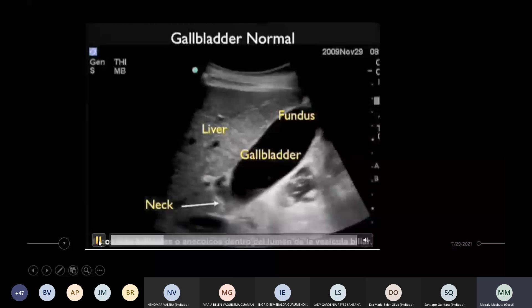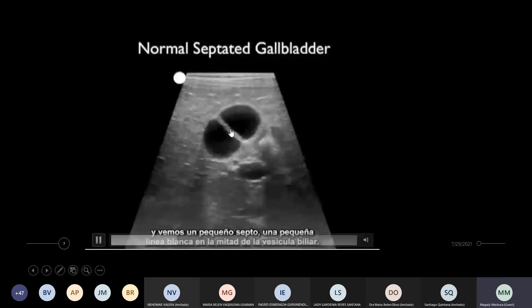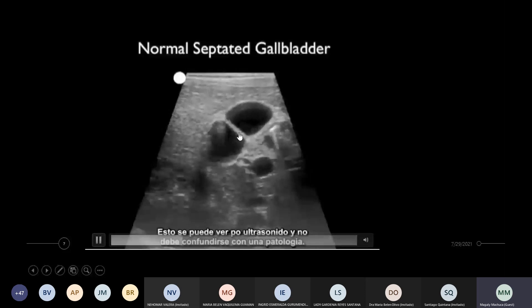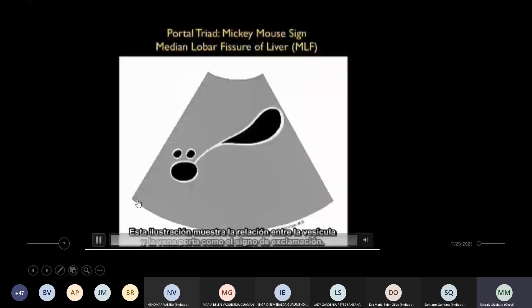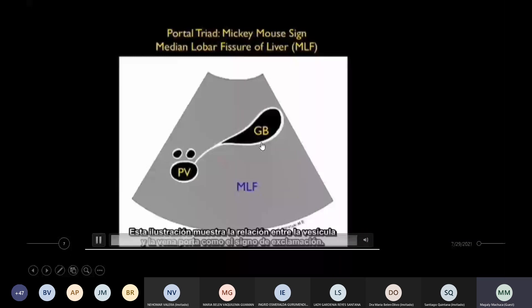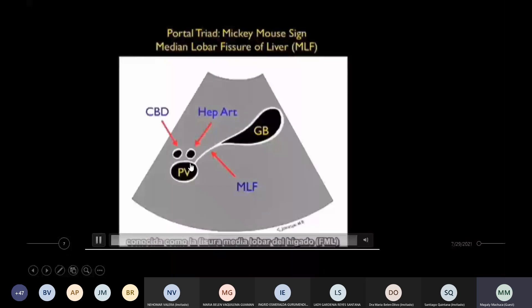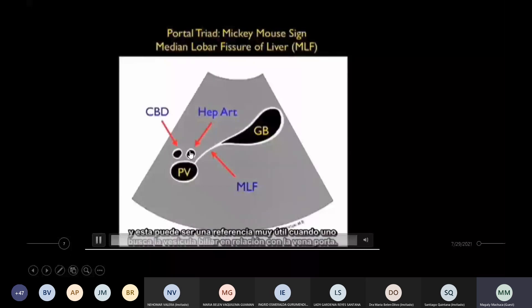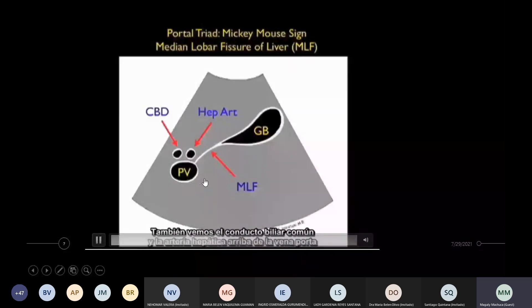Este en cambio ya es otro corte, es un corte axial, y podemos ver como variantes anatómicas estos tabiques, muy diferentes a un pólipo, porque son alargados y van de extremo a extremo. Entonces ahí es la diferencia, no vamos a decir que es un pólipo. Hay una relación que podemos describir entre la vena porta y la vesícula. Aquí dice que es un signo de exclamación, y vemos la vena porta, la arteria hepática y el conducto colédoco. Ayer les decía que era como un Mickey Mouse, esa era la referencia.